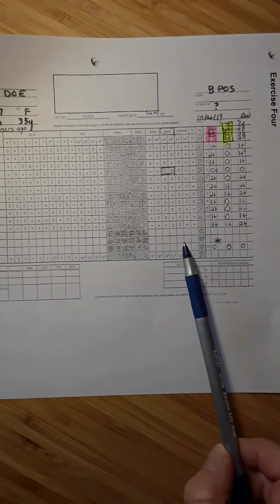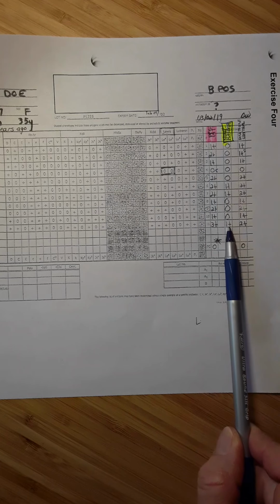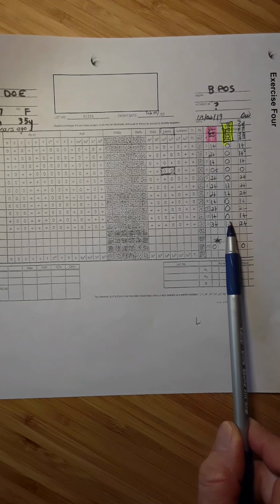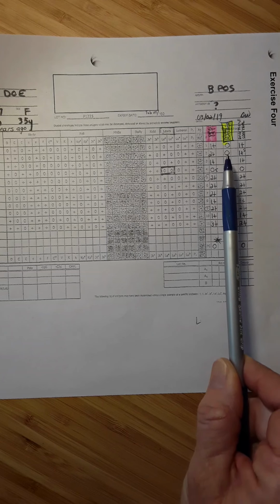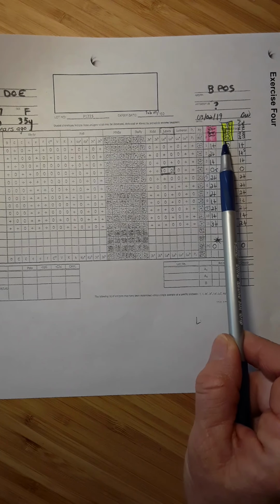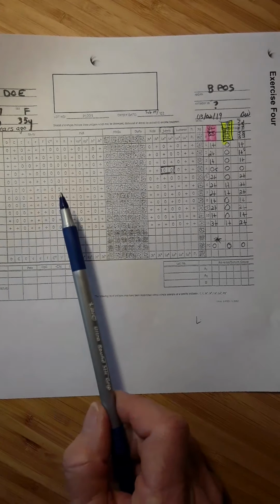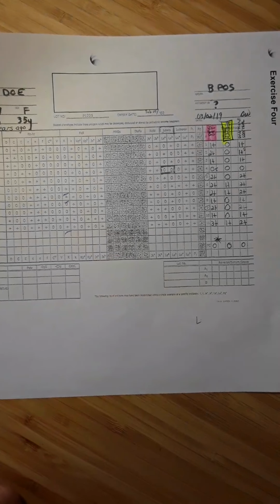So the important thing that we've found here is that the patient's plasma contains an anti-KEL. Okay, and the hard thing for students sometimes to grasp is this concept of the pattern of reactivity. Remember, these are tubes 1 through 11. They each had neutralized patient's plasma in it, but these tubes, 6, 7, and 11, still reacted with the panel cells, and sure enough, cells 6, 7, and 11 have the K antigen on them.